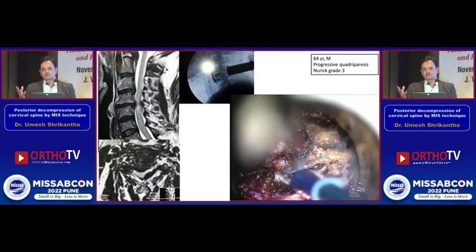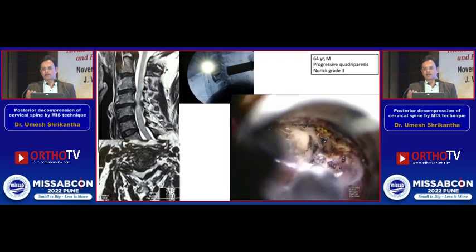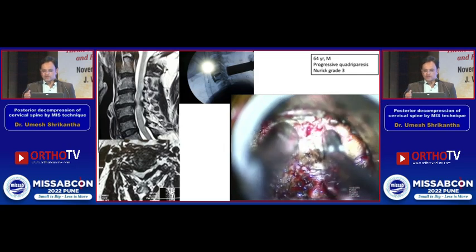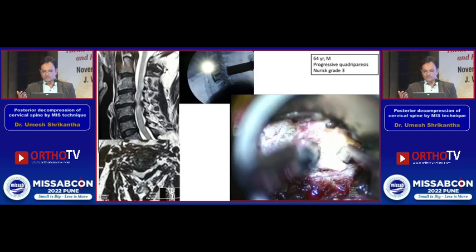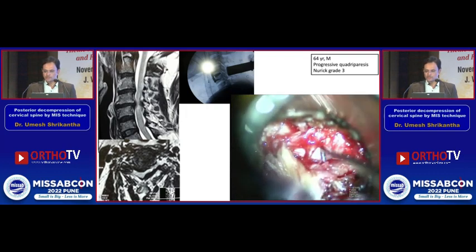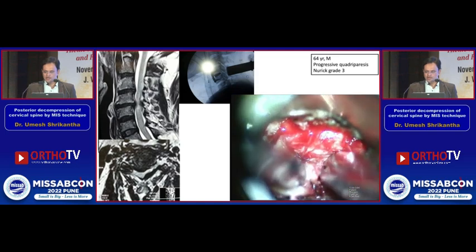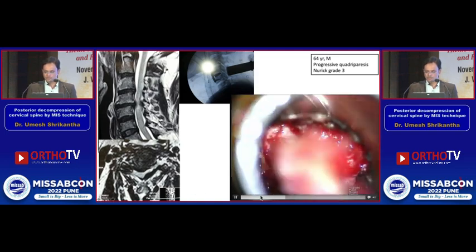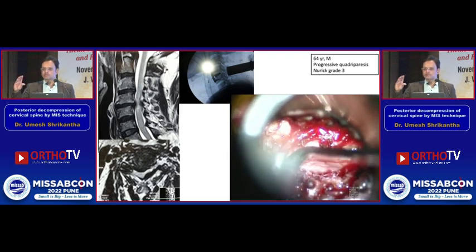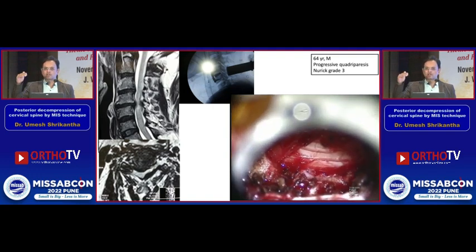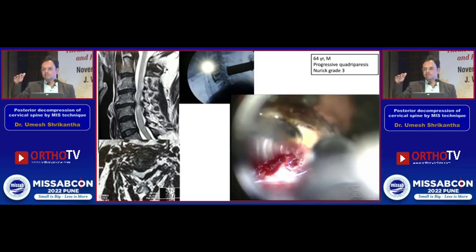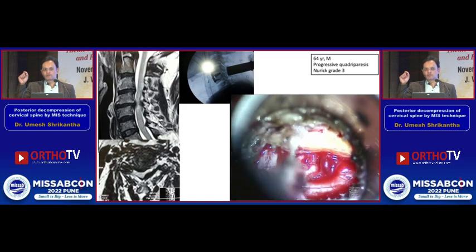We started with simple cases requiring both an anterior and a posterior approach. This is one case where we did an ACDF and also required a posterior decompression because of unilateral compression. This surgical video shows that we decompressed the ipsilateral level — the ligamentum flavum is being removed and ipsilateral cord decompression is done. Just like in the lumbar spine, we tilt the tube to the contralateral side and drill the inner cortex of the contralateral lamina with a 1.7 mm burr.